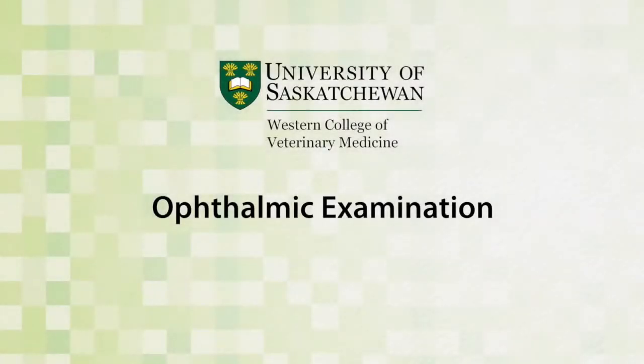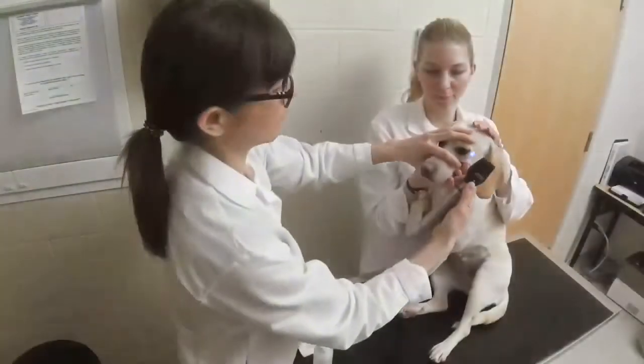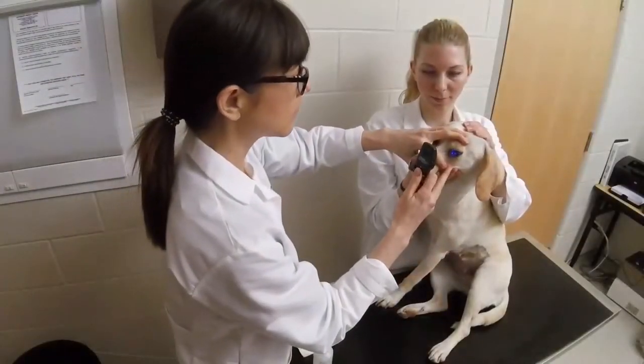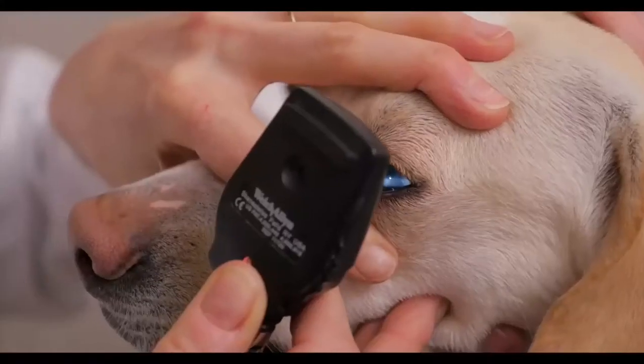Ophthalmic examination. The objectives of this video are to demonstrate how to do a complete ocular examination in small and large animal species. There are some important technical aspects to note prior to beginning the ophthalmic examination. The examination should be performed in a quiet room that can be darkened to minimize distractions and interfering reflections.